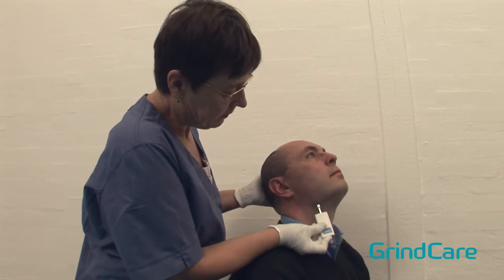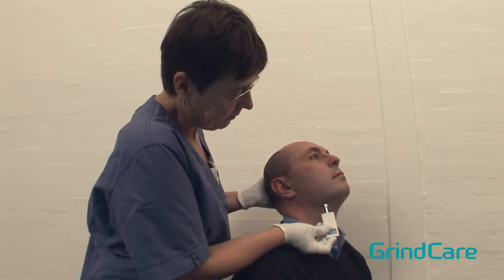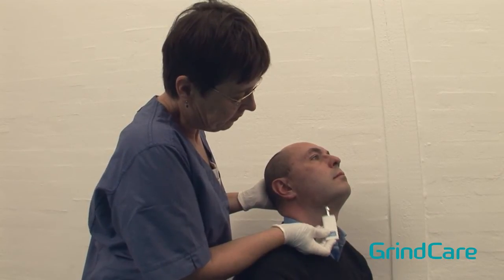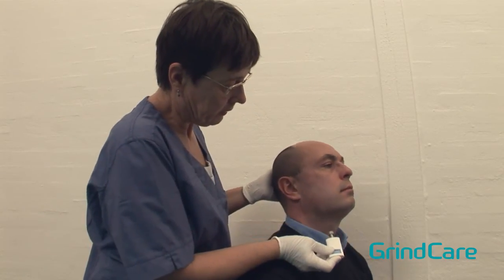Use the 500 gram or 1 pound of pressure version to palpate the posterior mandibular region. Ask the patient to tip their head back a little. Locate the area between the insertion of the sternocleidomastoid muscle and the posterior border of the mandible.